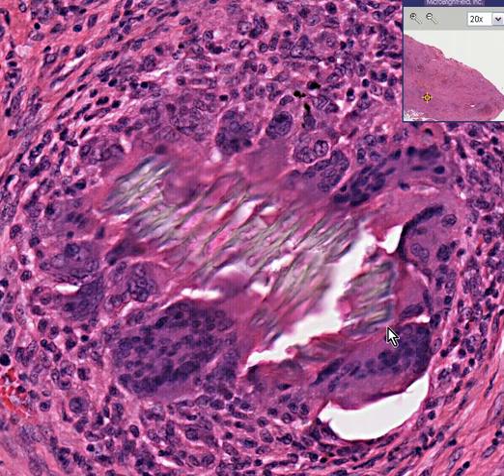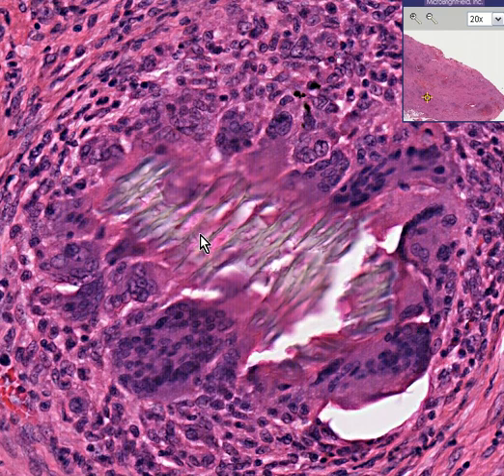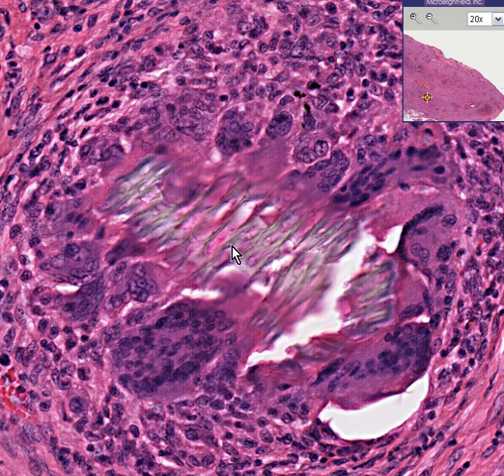This is some type of foreign material. Could it be fiber? Could it be a crystal? Could it be suture material? It probably could be anything. One way to emphasize it even more is to do polarized microscopy, and this may glitter or polarize or be slightly or significantly more refractile than everything else around it. This is a classical foreign body granulomatous reaction with multinucleated giant cells to foreign material.